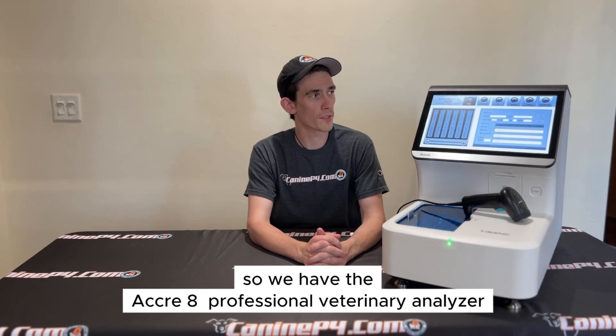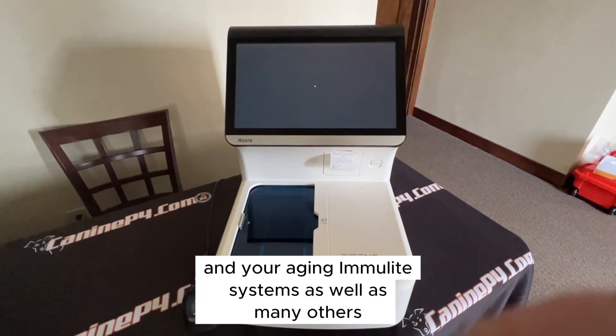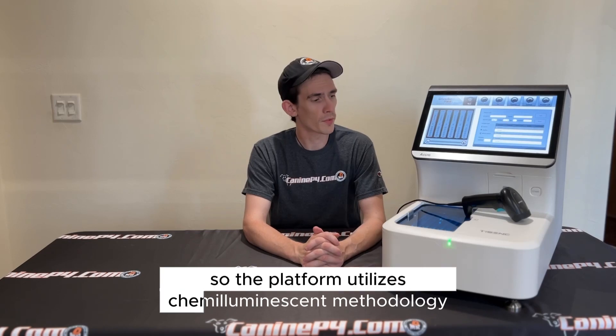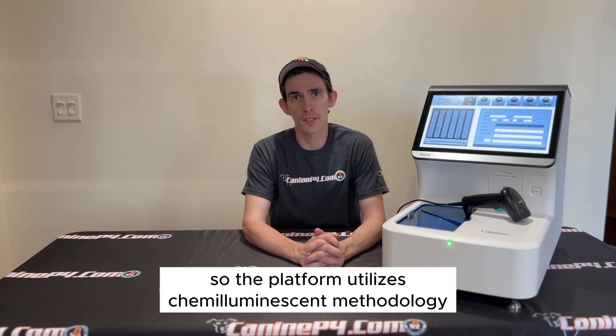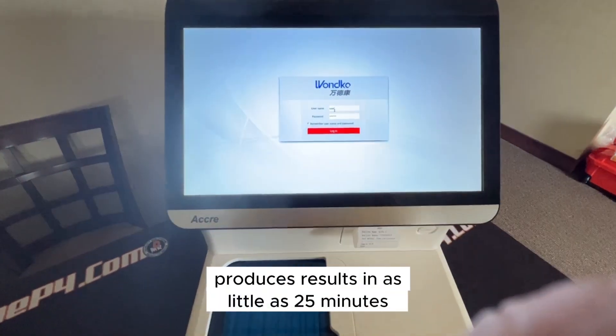So we have here a professional veterinary analyzer, the Accre 8, designed to replace your Minividas and your aging Immulite systems, as well as many others. The platform utilizes chemiluminescent methodology, gold standard in the veterinary testing world, and produces results in as little as 25 minutes.